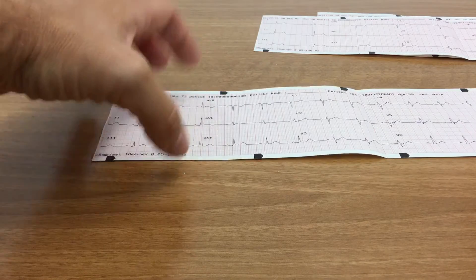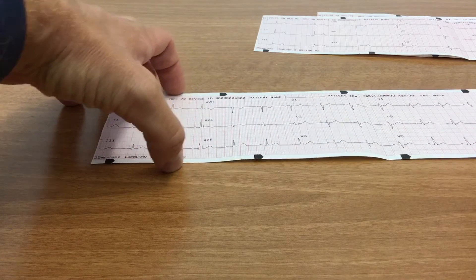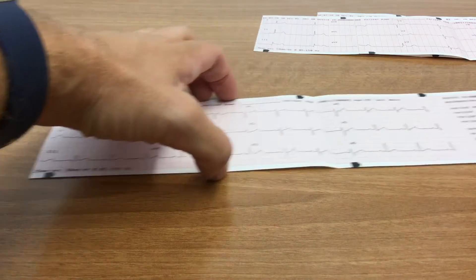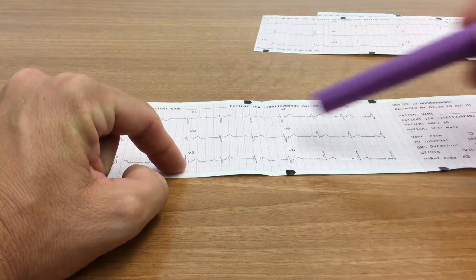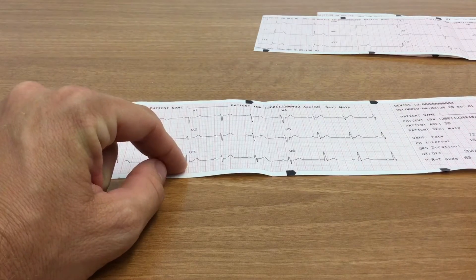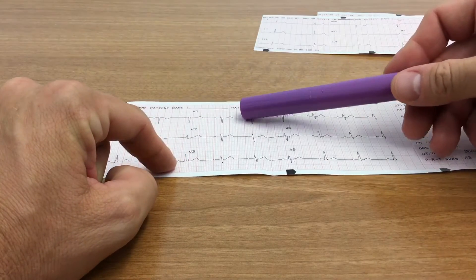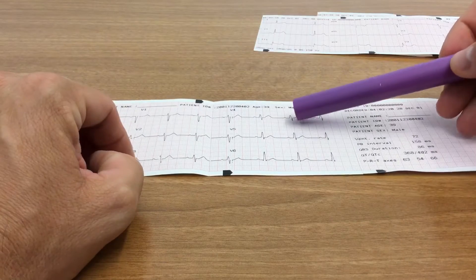So basically you have your limb leads here, your Einthoven's triangle here, you have your augmented leads here, and then the last two sections are your precordial leads, your V leads. So you start off with V1, V2, V3, V4, V5, and V6.